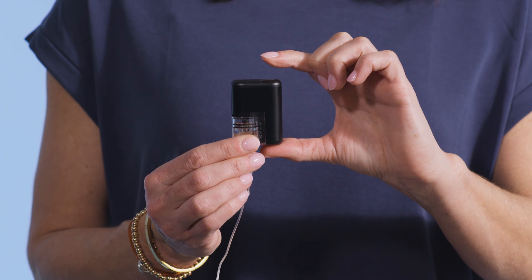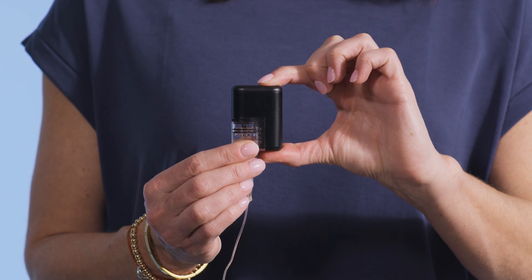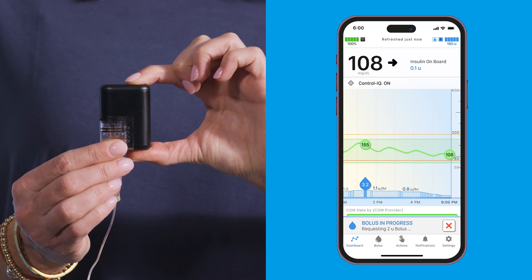When you're ready to deliver the bolus, stop pressing the button and wait for the pump to either beep or vibrate to confirm your desired amount. It will beep or vibrate once for each time you've pressed the button. After confirming the amount, press and hold the pump button for several seconds to deliver the bolus.